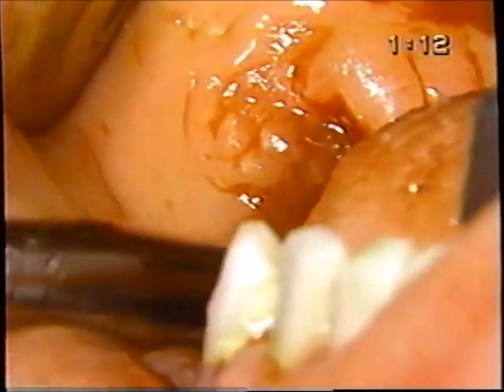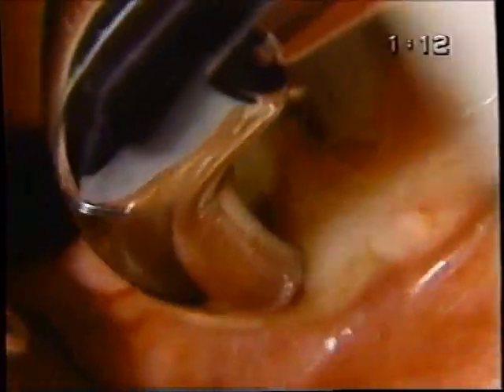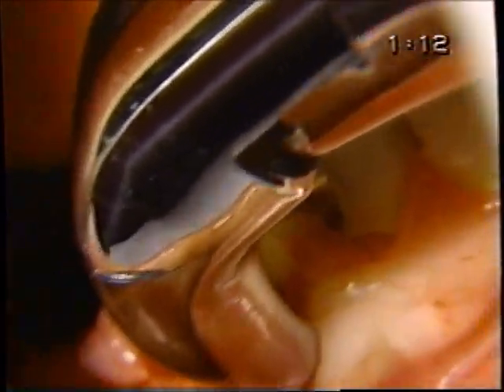Okay, that's great. We've got a portion of a root down there that we need to get out. There it is. We've got good engagement, long axis. I gave a little bit of extra anesthetic for this one in anticipation of one that might be a little bit harder.